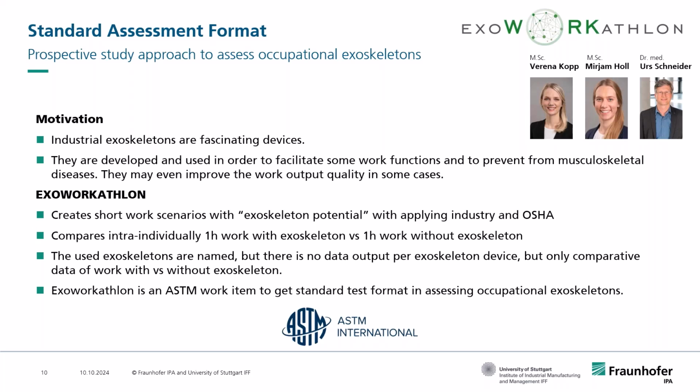It is a prospective study approach to assess occupational exoskeletons. It creates short work scenarios, the so-called parcours. I will show you soon on the next slide. They are parcours or scenarios with exoskeletal potential, applying industry and OSHA standards, of course. It compares intra-individually, like on the same person, 1 hour of work with an exoskeleton versus 1 hour without an exoskeleton.